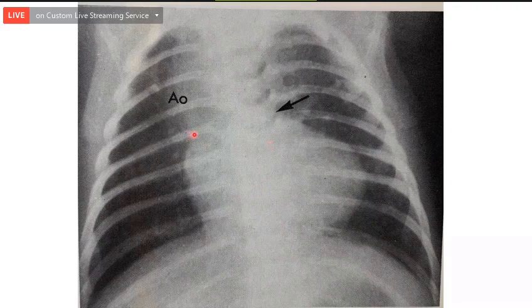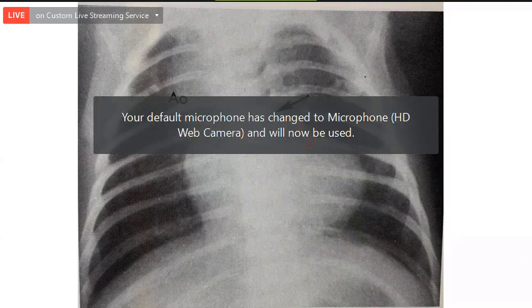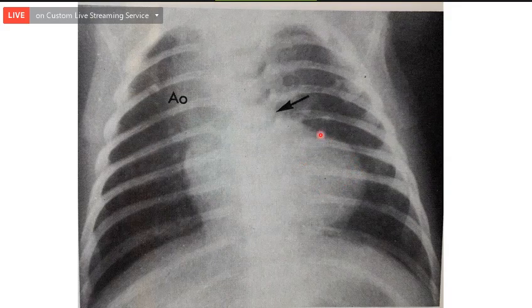What about the pulmonary vascularity? It is less, sir. It is less, and also you can see that the pulmonary bay, actually it is a bay. See, the pulmonary artery segment, actually it is a bay. So in a patient with tetralogy of Fallot, you can see the upturned apex, pulmonary bay, pulmonary vascularity significantly reduced, and sometimes the aorta can be prominent. So all put together, that will be more in favor of a patient with tetralogy of Fallot. Whenever you are suspecting a cyanotic congenital heart disease, you should always look at the situs. Here the liver is on the right side and you can see the gas shadow. So the stomach is on the left side.